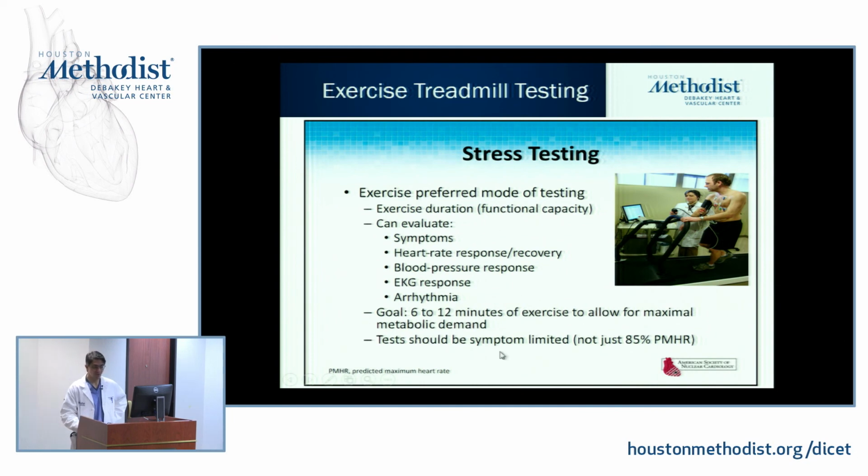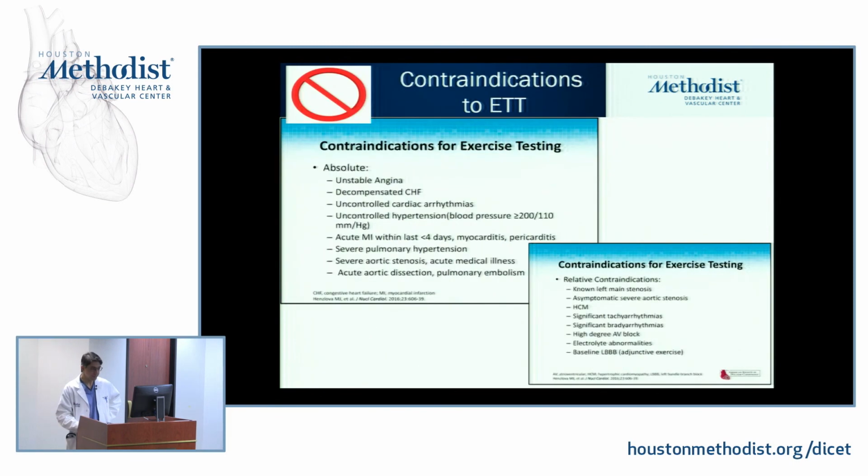One important note is that you want to get your patient's heart rate up to at least 85% of the predicted heart rate. Anything less than that can lead to a reduced sensitivity of your diagnostic testing.